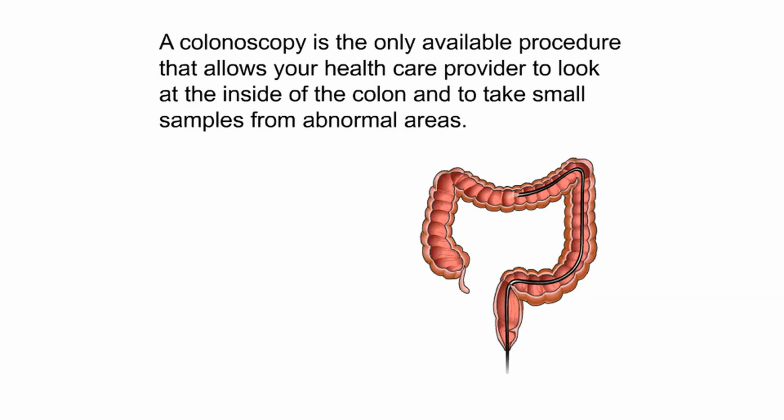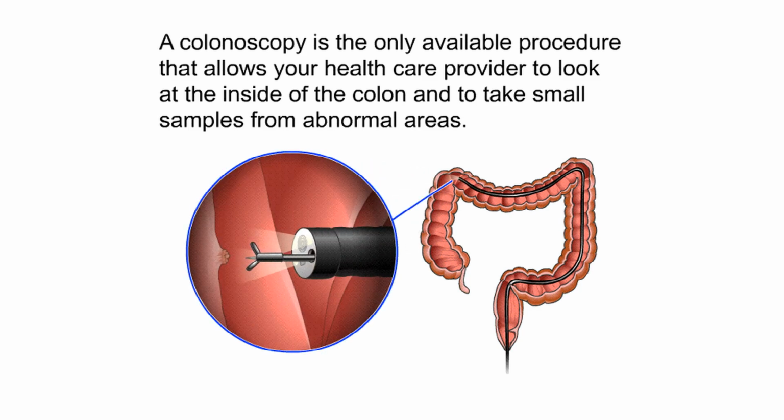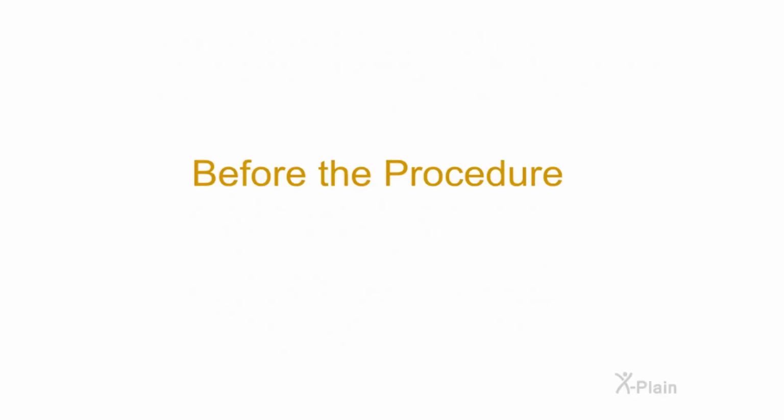A colonoscopy is the only available procedure that allows your healthcare provider to look at the inside of the colon and to take small samples from abnormal areas. Before the procedure.